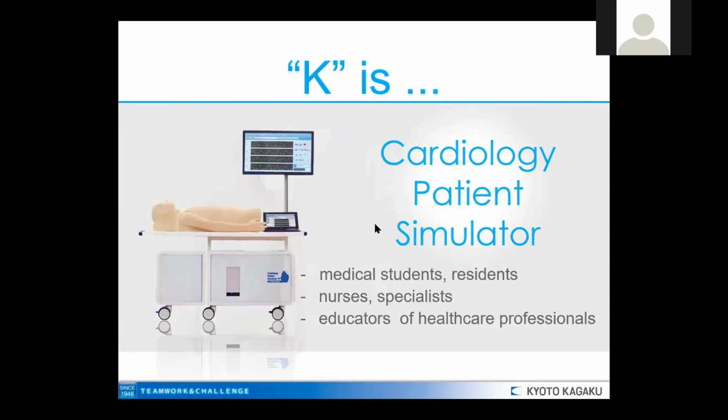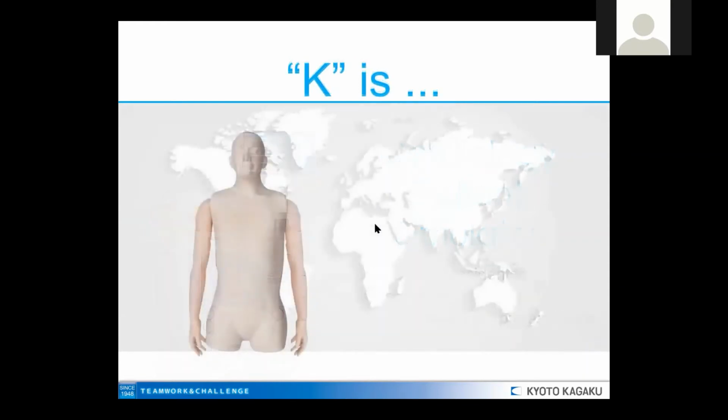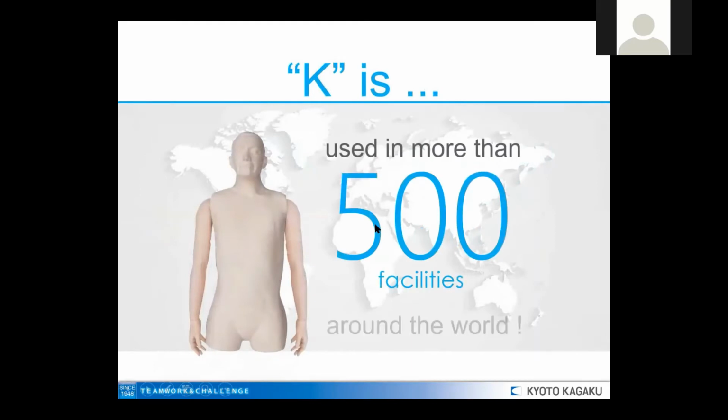And because of that, nowadays it's being used in more than 500 facilities all around the world, not only in Japan, but in many places. This model is being used right now.